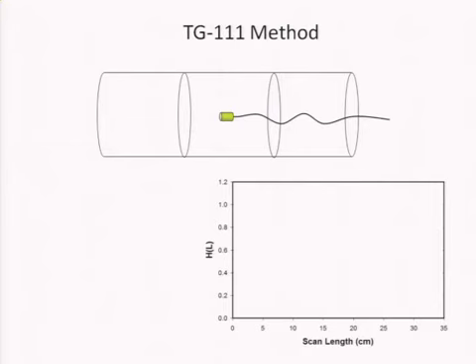So the TG111 methodology for assessing this so-called rise to equilibrium curve goes something like this: you put a point ion chamber in. Dixon refers to it routinely as the Farmer chamber, but it's really not an older Farmer chamber, and the people who make the chambers ask me to quit calling it a Farmer chamber. So you can do a small scan length and measure a value.